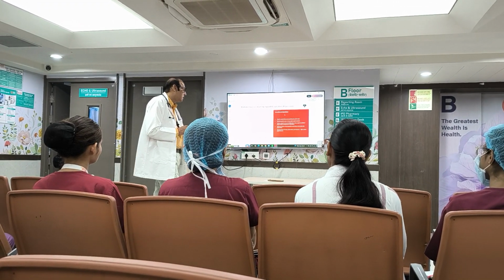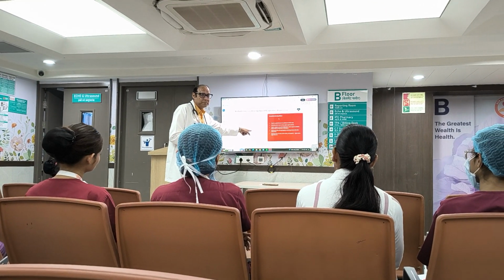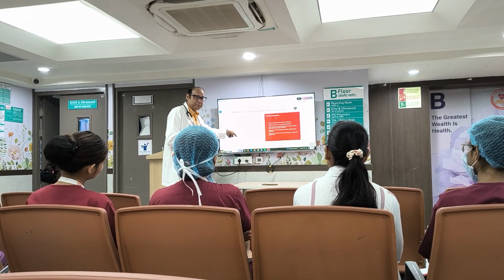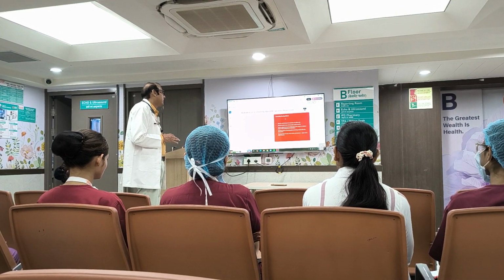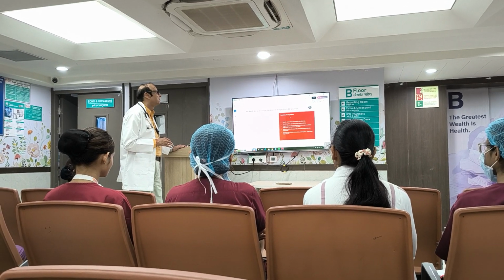तो ये देखो, ये PCO2 is 62 and bicarb is not compensated. If not compensated means having respiratory acidosis, right? So intubation, acute uncompensated respiratory acidosis, bedside emergency. इसमें ऑक्सीजन देते हैं, you have to give oxygen. Okay.